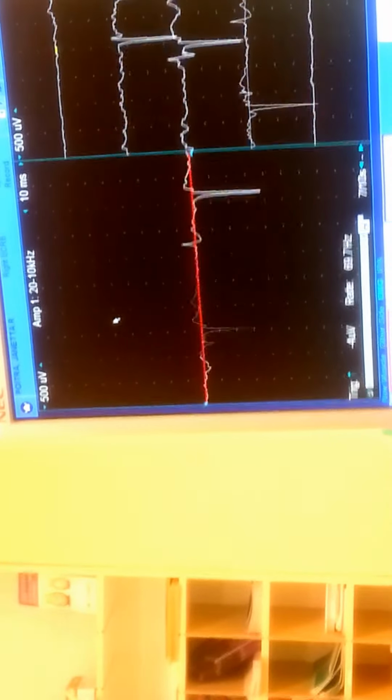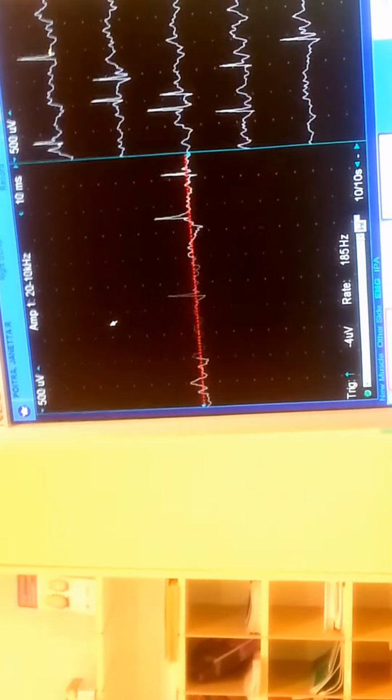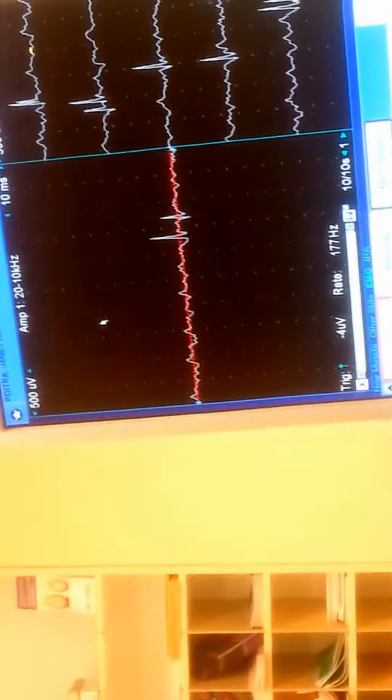Push back. See how skinny? Push back. Those are motor units. Excellent. I like it. Take a picture of that. That's normal. All right. Now let's do some finger extensors. A C7 muscle. Kind of jump around a little bit.